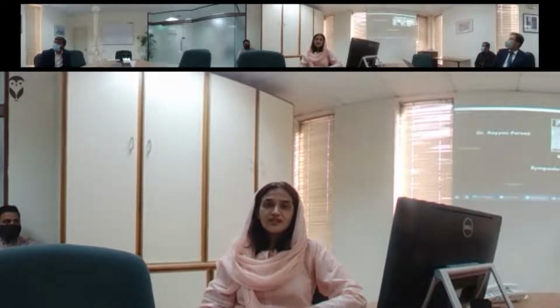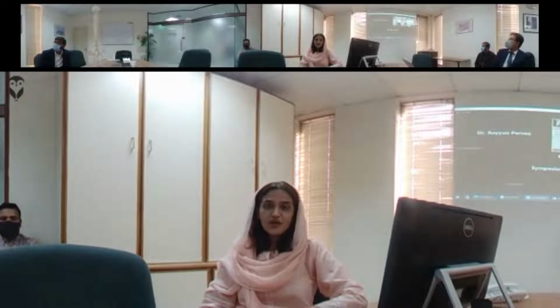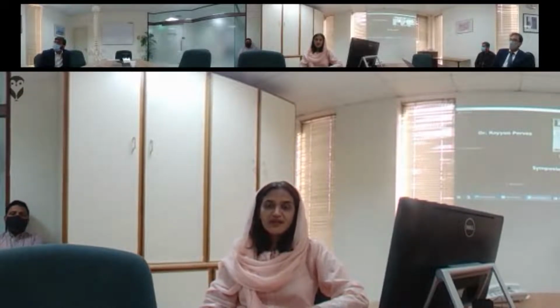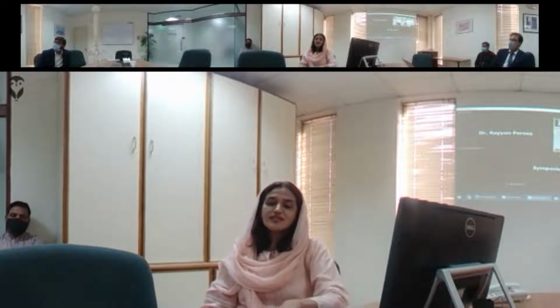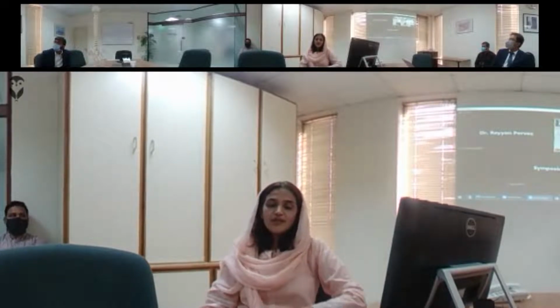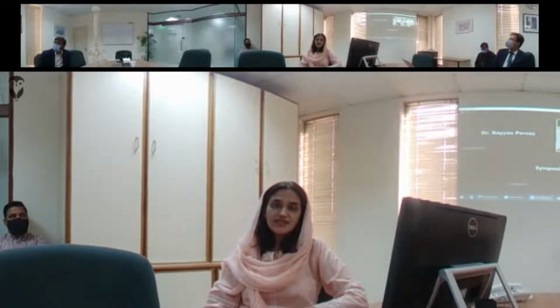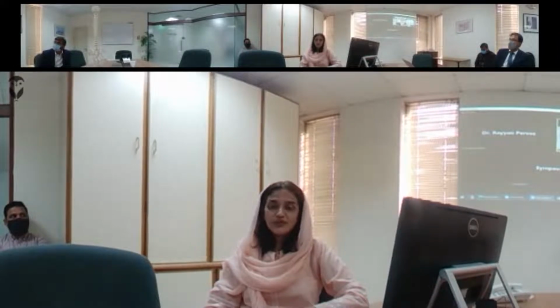Understanding radiological imaging is quite essential for our work, be it therapeutic or for diagnostic purposes. With that, let's learn from Dr. Zahid Wahid how we can get more out of our C-arm. And it would help us in optimizing the images and address the safety issues related to it.